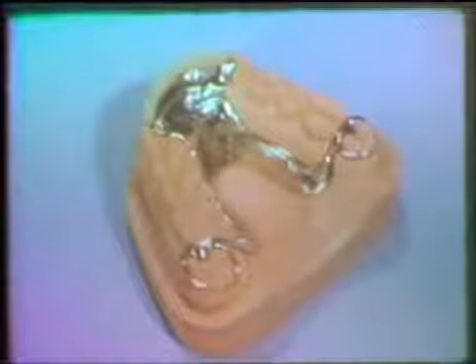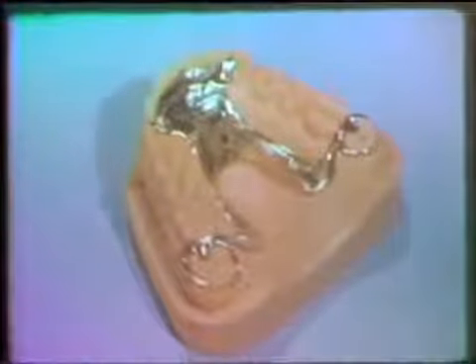Part 1 in this two-part series of films will consider the use of the rotational path concept in the maxillary class 4 partially edentulous arch. Part 2 will describe its use in the maxillary and mandibular class 3 partially edentulous arches. These are the three most common situations in which it may be most effectively utilized.